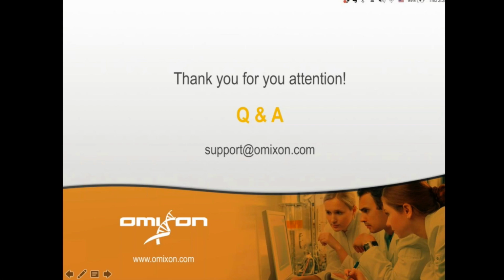Another question is, can I also use the MiniSeq sequencer for sequencing for both Holotype and ABO, I assume the question is. Yes, definitely you can. Our products work very well with both MiniSeq, MiSeq or NextSeq machines. So definitely the answer is yes. And we have a couple of customers using the MiniSeq machine also under accreditation.